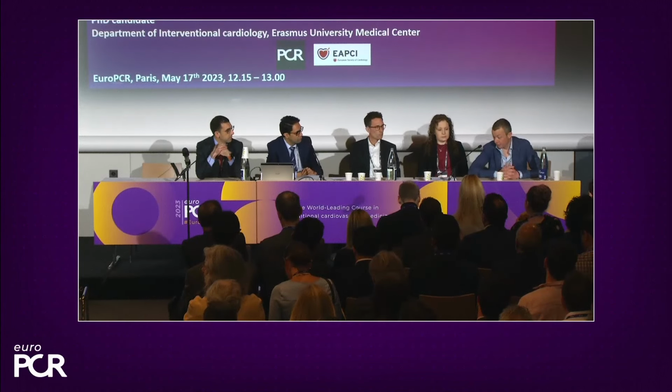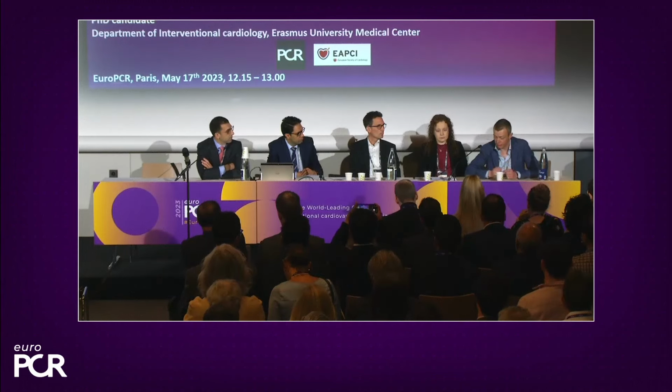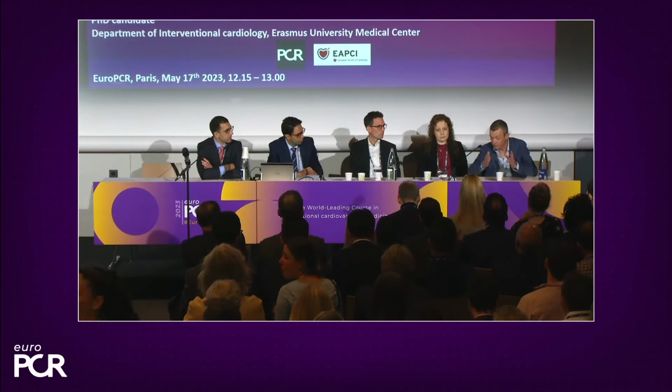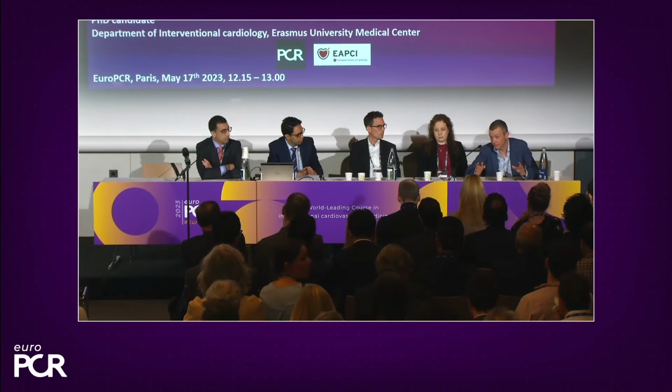So yeah, this is a very good comment. We initially validated the technologies in a single center approach in Rotterdam, and we did a FAST Extend trial in which we validated angio-FFR, VFFR versus FFR in almost 300 patients. And we were able to look into subgroups with patients with diffuse disease, bifurcation lesions, calcified lesions, and we were able to conclude that the diagnostic accuracy of VFFR is very consistent among each of these individual subgroups. Does that cover all of the clinical indications?